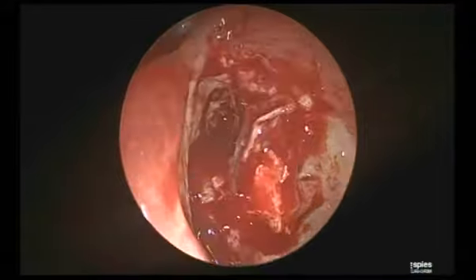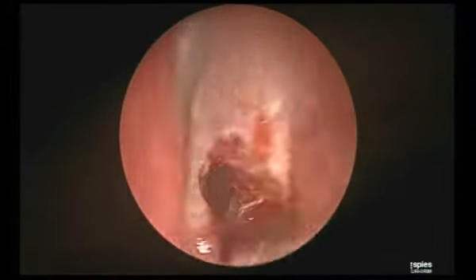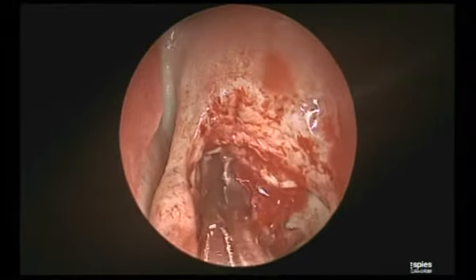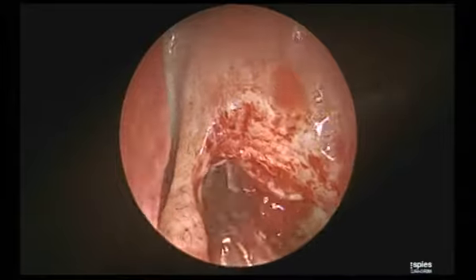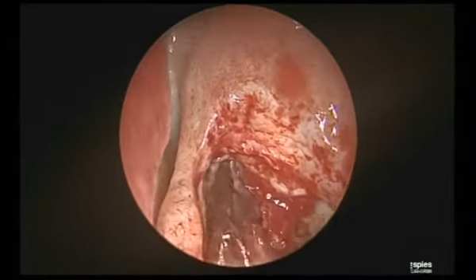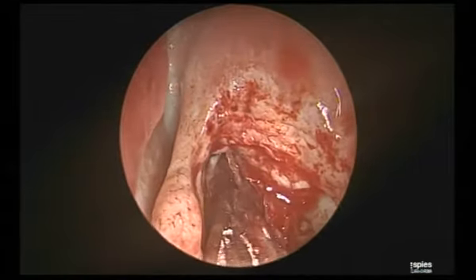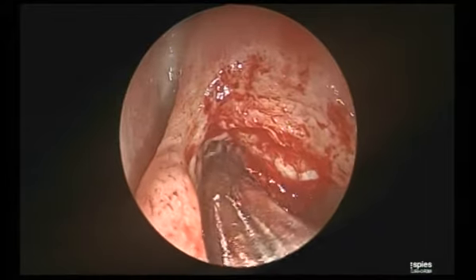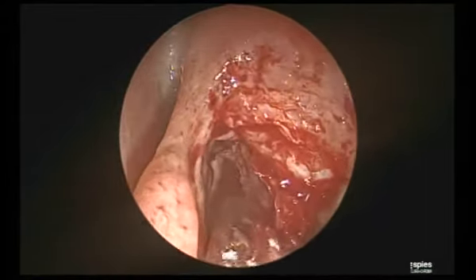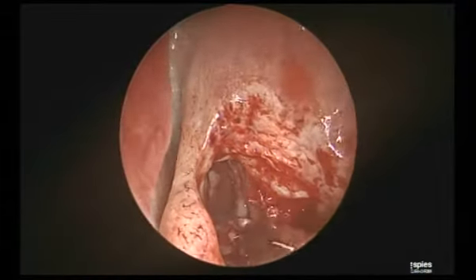Now I've removed this fractured lamella. This is the simplest version which we have developed and have shown in our course. So let's use the word safest, because this is protecting the anterior ethmoidal artery. Simple is a matter of training. The moment you cross your limit, you can land up with complications. If you stay within your limits, you can't.